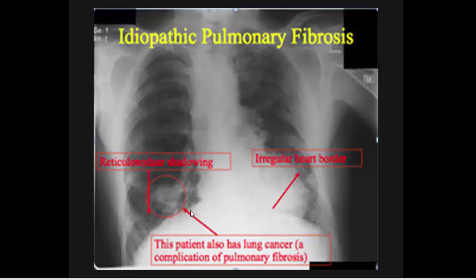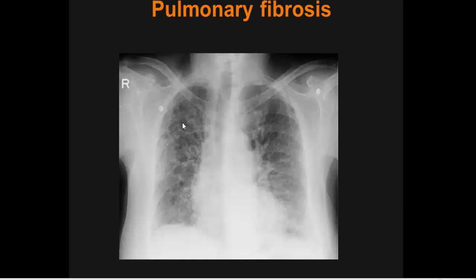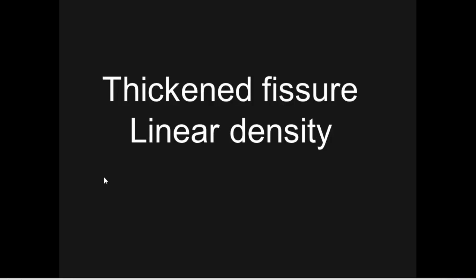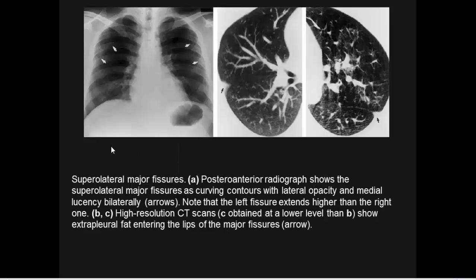Pulmonary fibrosis presents with reticulonodular shadowing. Radiation fibrosis produces linear markings and linear density. Pulmonary fibrosis is scattered bilaterally throughout both lungs. The transverse fissure presents as a linear density; the normal major fissure is visible on the right and on the left, including superior-lateral major fissures.